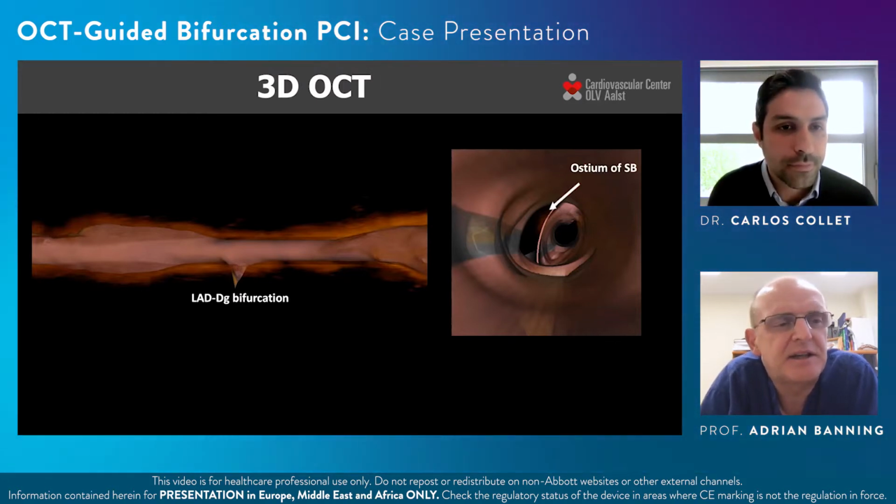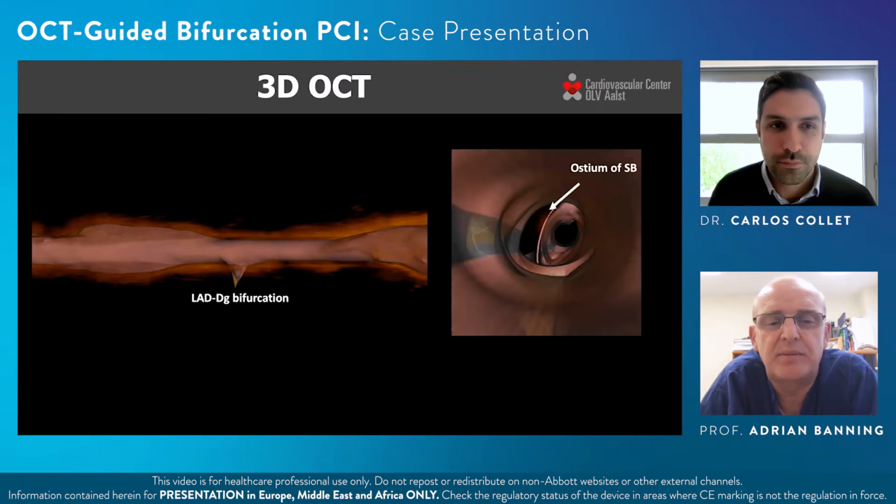I think we can take it as a given that this is an important diagonal. As you mentioned, it runs long, and we've heard over the years that the length of the diagonal is really very important with regard to predicting whether that's going to be an important diagonal for us to look after.